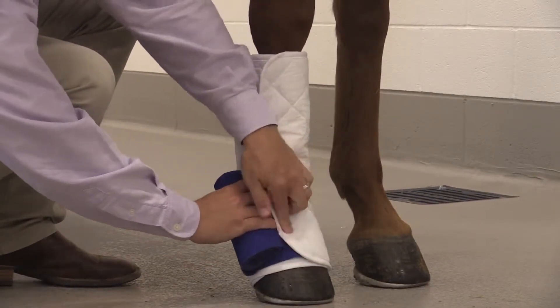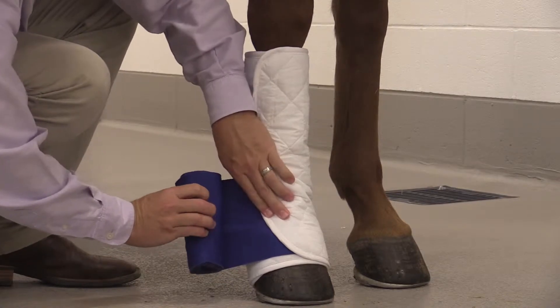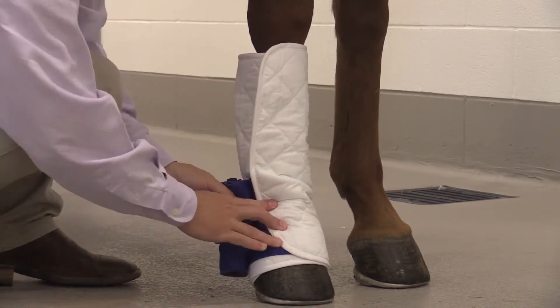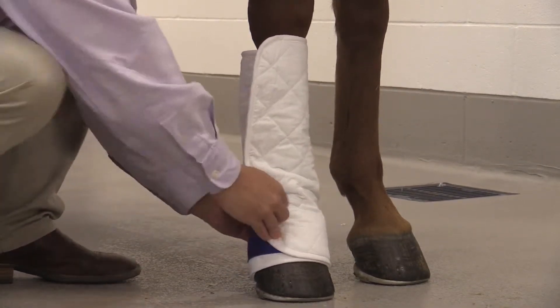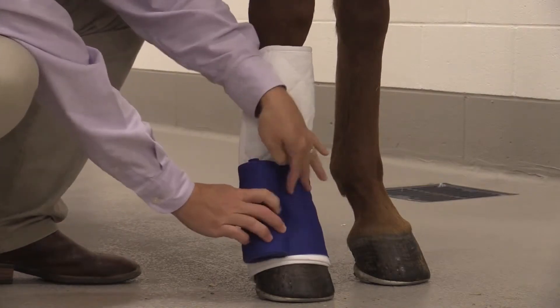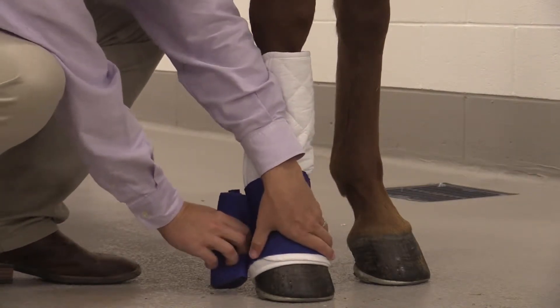The next layer will be a polo wrap. There are a lot of different types of polo wraps. Ones that have a little bit more elasticity can help with the contour, placement, and hold of a support wrap.